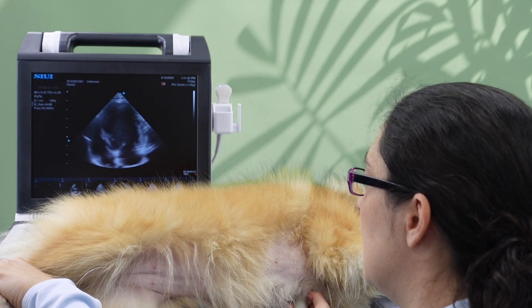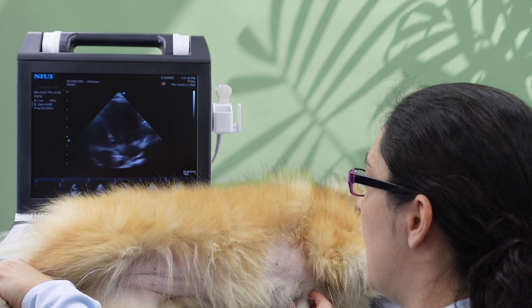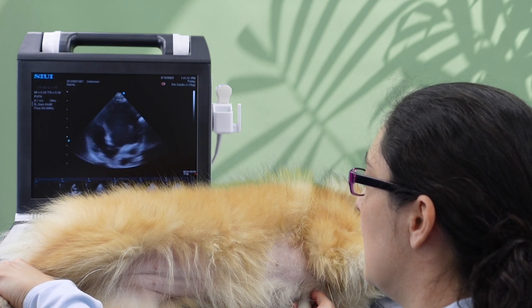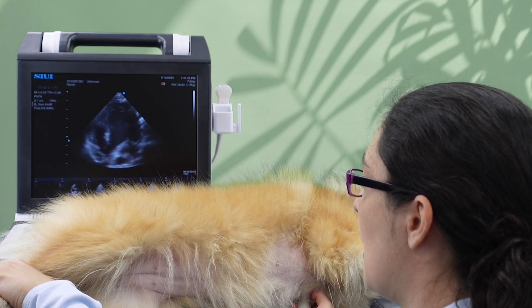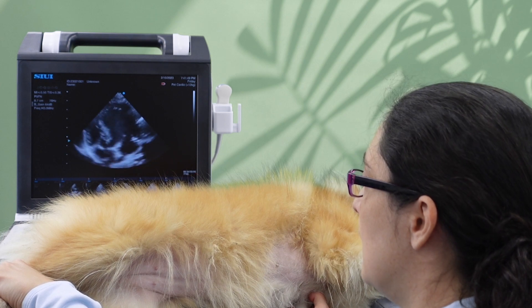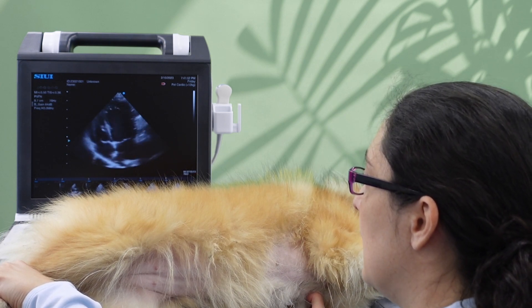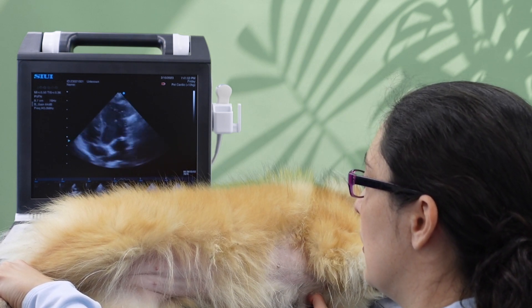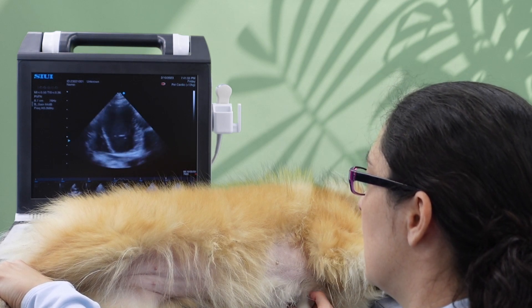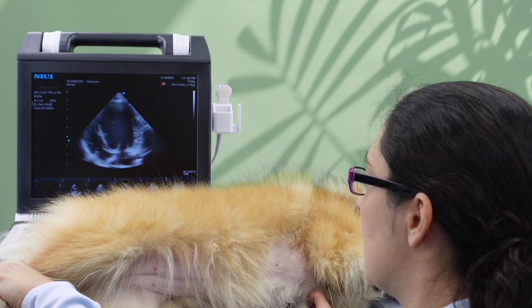And finally, making sure that that aorta is completely closed off so you can't see the aortic valve or any of the outflow tract in your picture — that you've completely closed it off so that your ventricle looks like this.